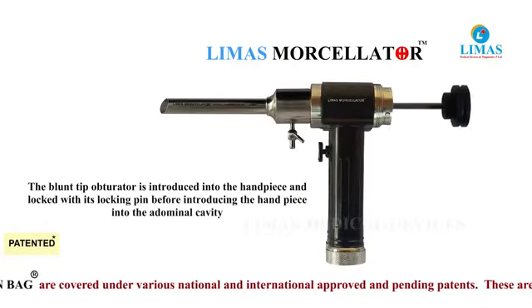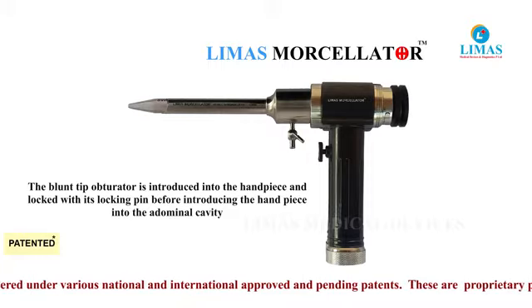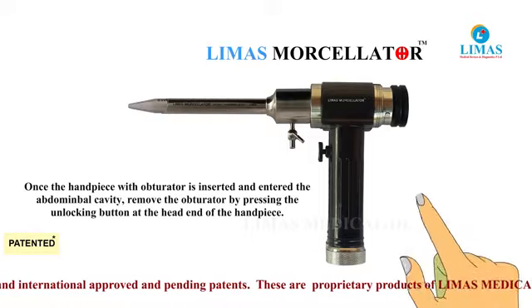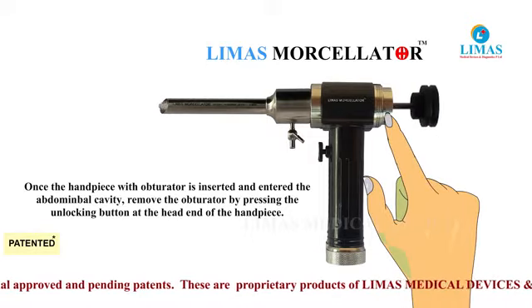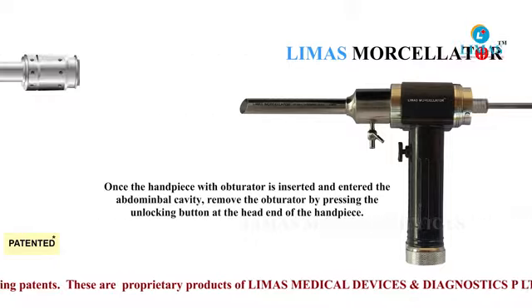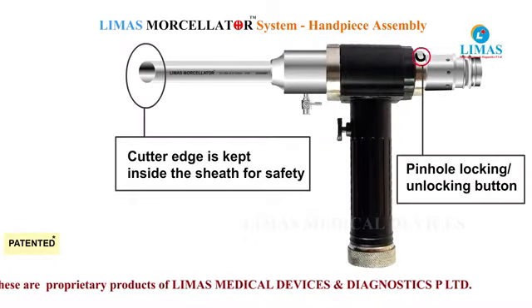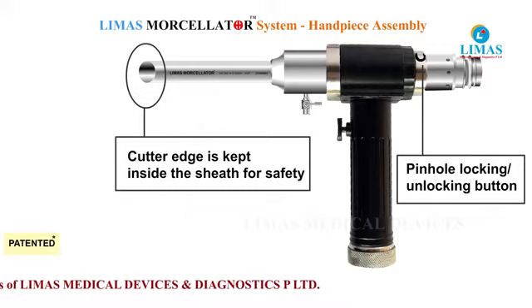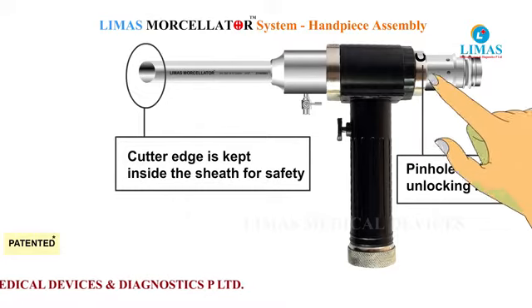The conical blunt tip obturator is inserted and locked onto the handle. Once the hand piece has entered the abdominal cavity, remove the obturator by pressing the unlocking button on the handle. Then the cutter blade is inserted into the hand piece and locked at the primary pinhole slot so that the cutter edge is not exposed.